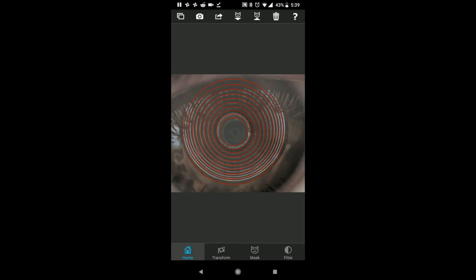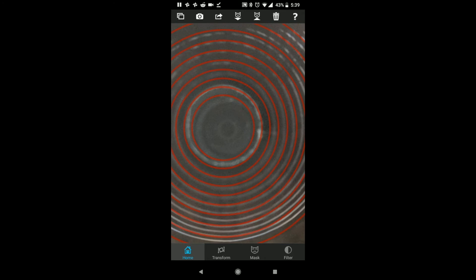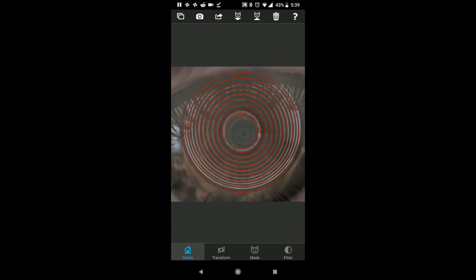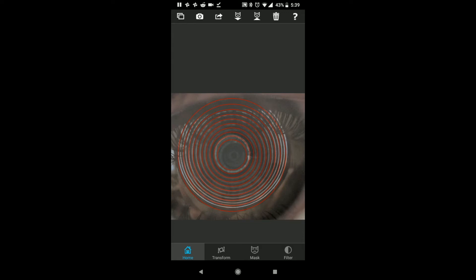But I want to show you. So if we zoom in here, what we're looking at is we're looking at the spaces between the standard rings and Emma's cornea, and Emma's cornea is fairly round, so there are not going to be a lot of gaps here. But you'll see when Emma measures my cornea, I have a lot of cylinder, and it's going to be easier. So that is how we do things here, and that is it for Android.